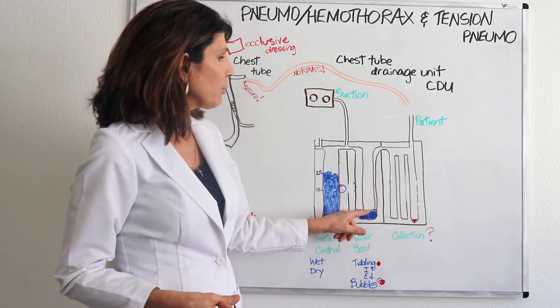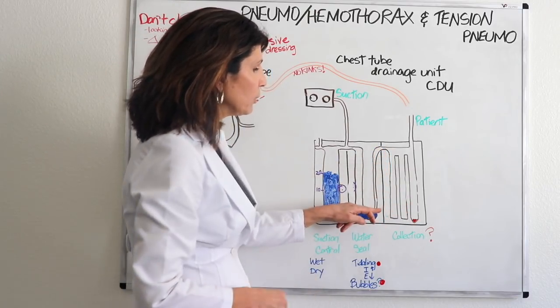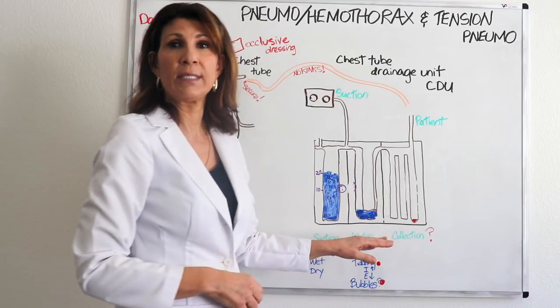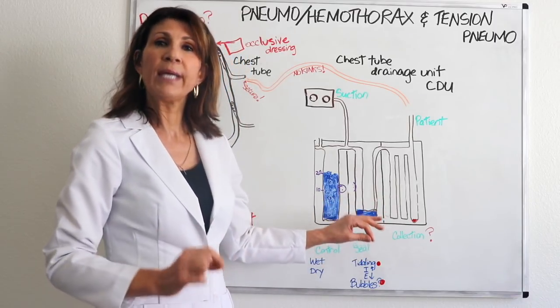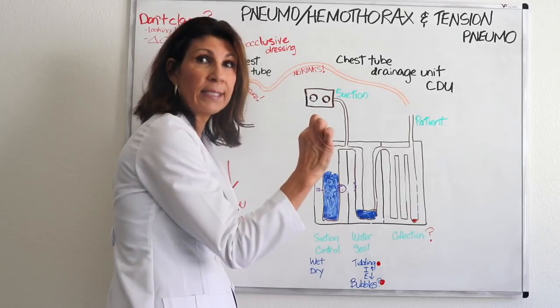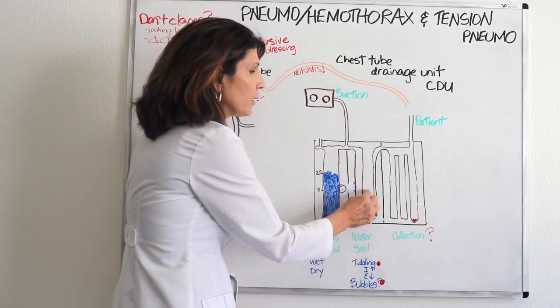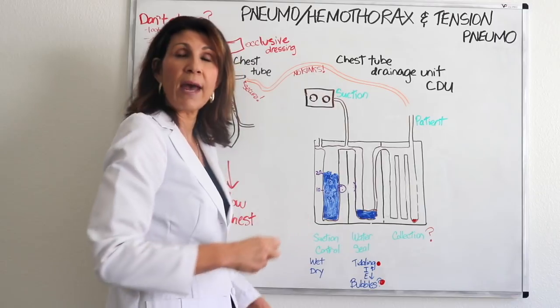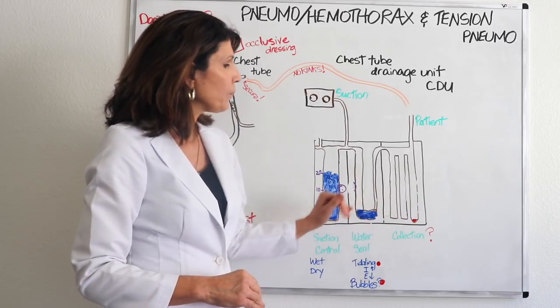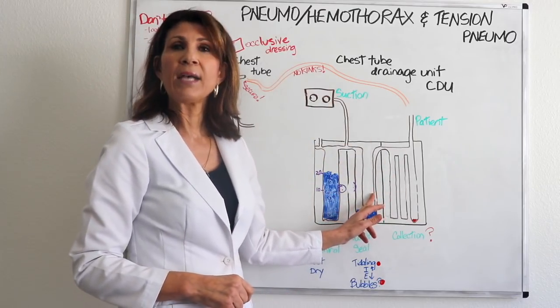So what the water seal chamber provides is a water seal, so that, I call it a straw, this straw, when it's below the level of the water seal, will not allow air to get back up into this closed system. With that being said, one of the implications for setup is that this water seal chamber is filled to the level that it states. It's usually 2 centimeters of water pressure, and it is marked for you. There's usually a little port for you to inject that sterile water, and your responsibility is to ensure that the water seal is there. And also, this is where you can detect if this closed system has leaks.